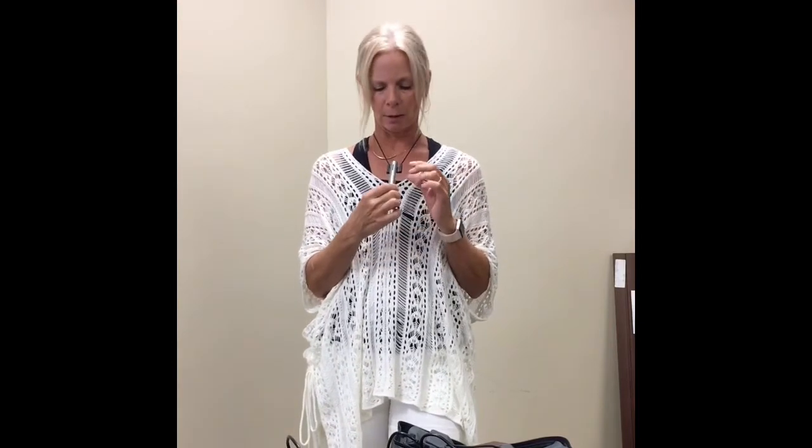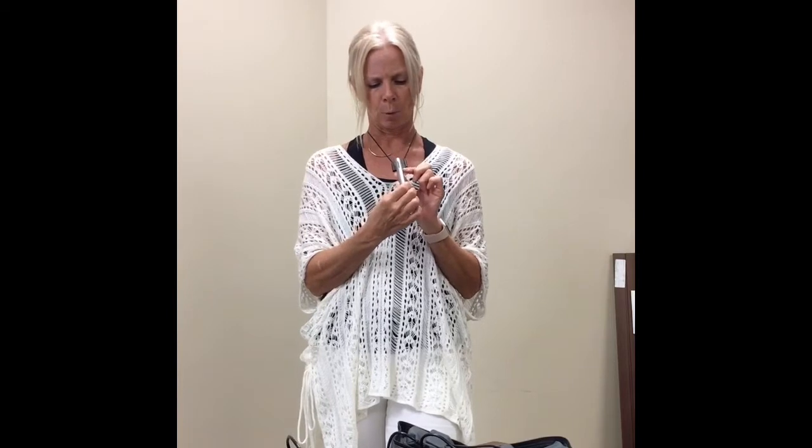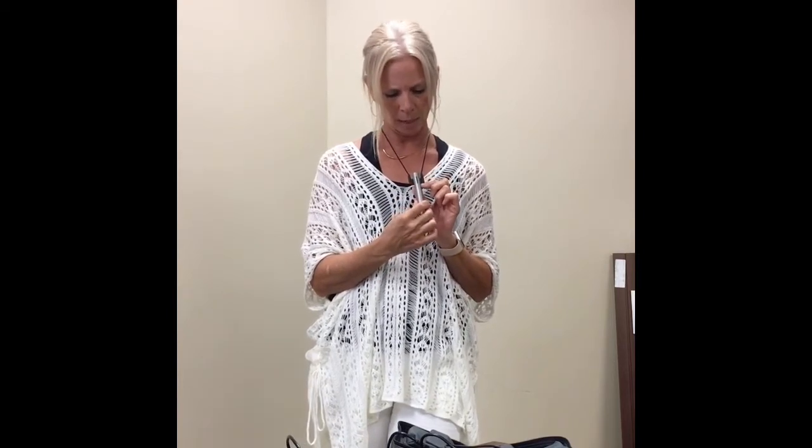Now, it's important that you remember that you're in mute mode because when you start talking again, addressing the class, we do teach our students to remind you to give prompts if you forget to help you to remember to unmute the microphone, but it's really important to try to remember, if you can. Just press it one time, unmuting, and you're flashing green again, indicating that you are connected.